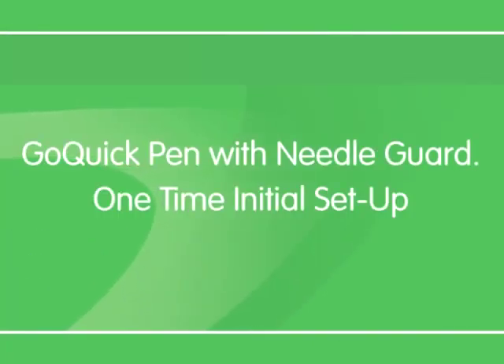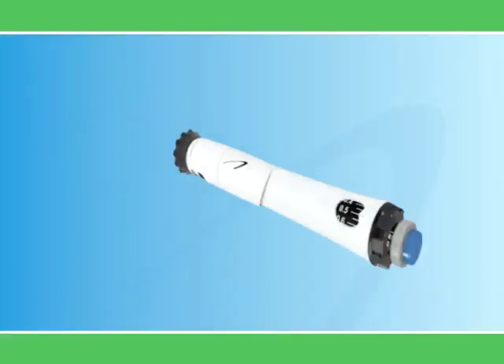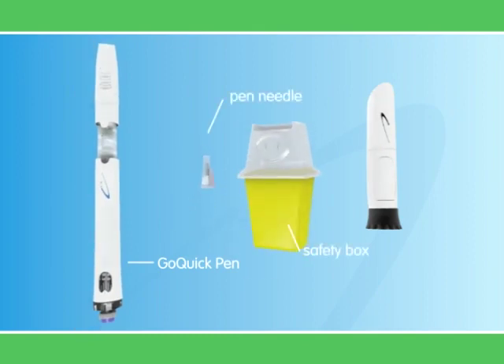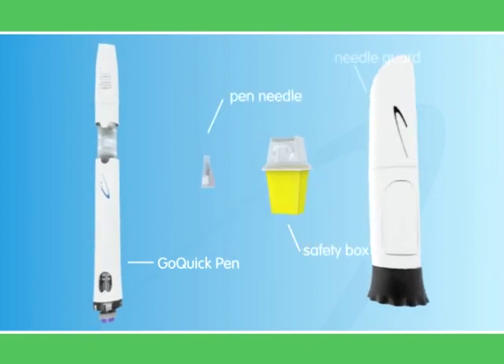The Go Quick Pen may also come with an optional needle guard that hides the needle from patients who are apprehensive about injections. Before setting up the pen, check that you have these parts: a Go Quick Pen, a pen needle, a safety box to discard the needles, and a needle guard.